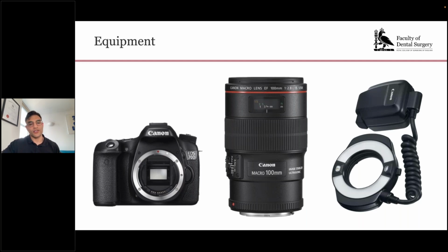And really, it takes some fantastic quality photographs, and it does the job absolutely serviceably. So you don't need to spend a fortune to take good quality photographs. What you also need is a macro lens. Now, what you see in the middle there is a macro lens, and this allows you to take magnified and zoomed in photographs with exceptional detail, exactly what you need for dental photography.